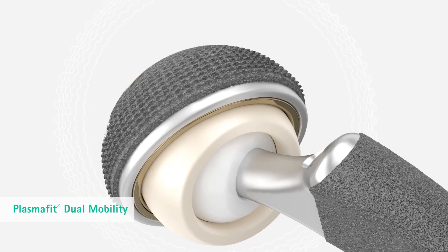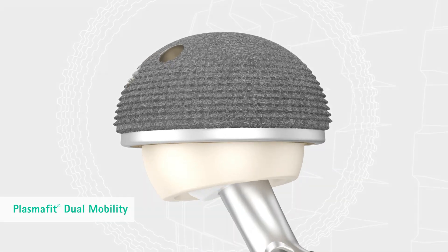The dual mobility head is made of Vitaline. The PlasmaFit system offers intraoperative flexibility in the choice of bearing options.